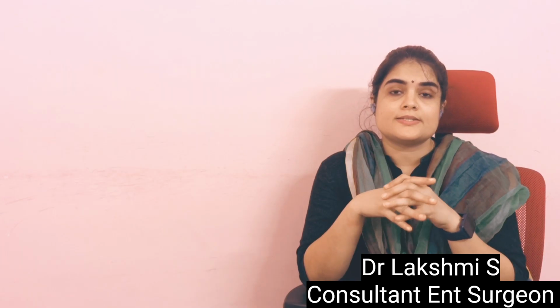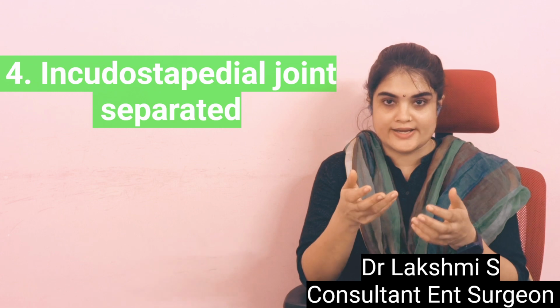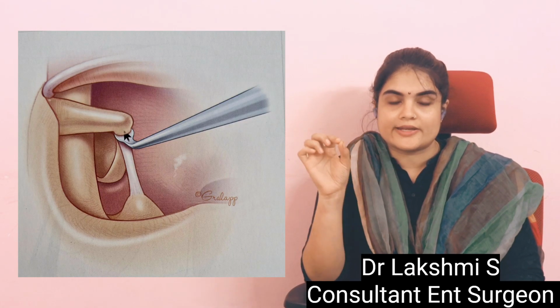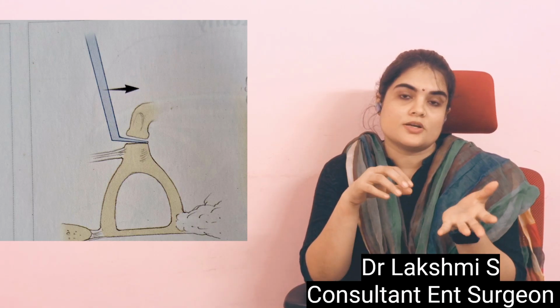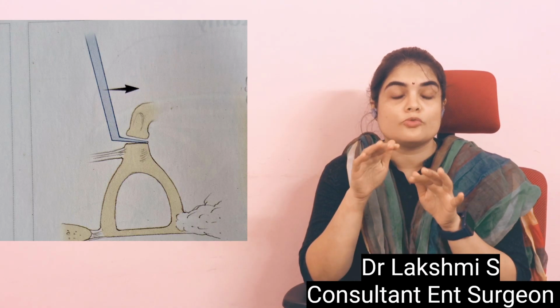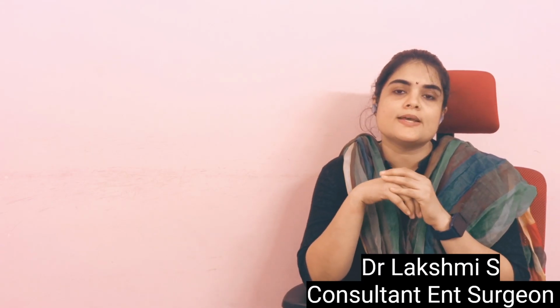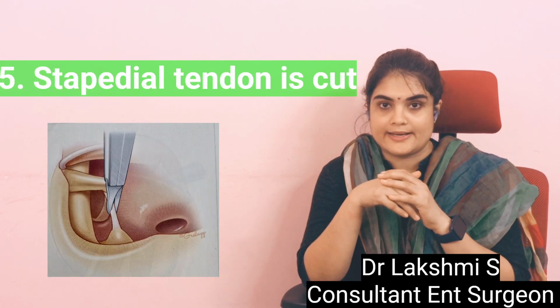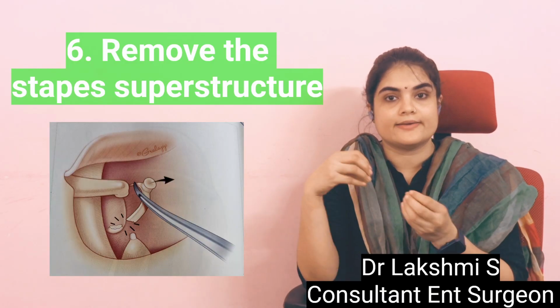The first step is dislocation of the stapes from the incus, that is, dislocation of the incudostapedial joint. A slight outward pressure on the incus will show the gray line of the IS joint. That is the area where you can dislocate the IS joint. Make sure that you don't put too much downward pressure on the stapes, as it can cause fracture of the footplate. The movement should not be from side to side because this can again cause fracture of the footplate. So the IS joint is separated, and then the stapedial tendon is cut close to the pyramidal eminence. Then you can fracture the superstructure of the stapes downward towards the promontory and it can be removed.